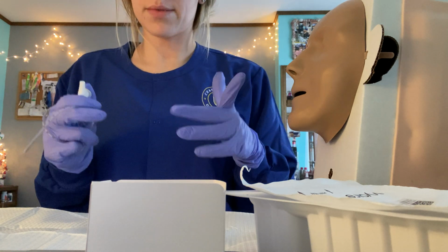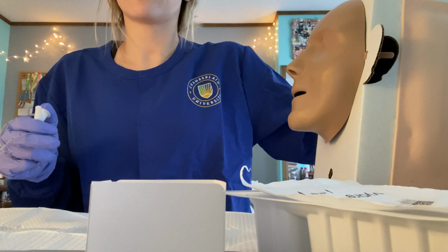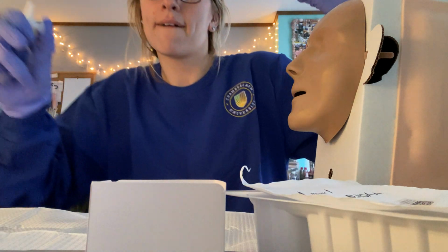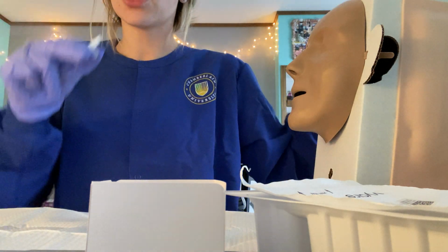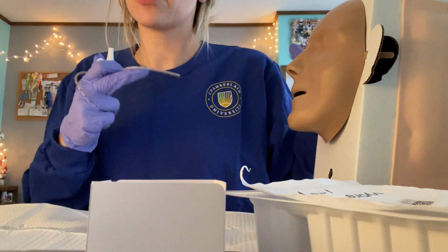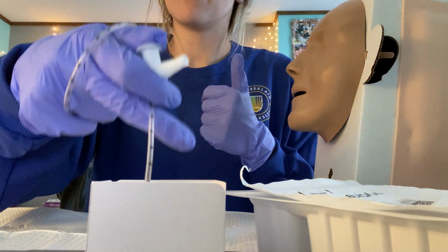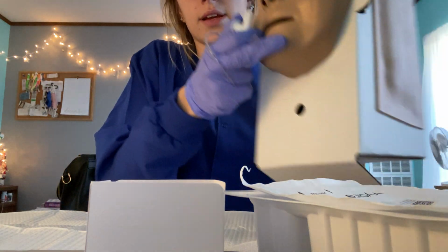Okay, so with my non-dominant hand, I'm going to turn on the suction and I'm going to regulate it. For adults it's from 100 to 110, 115, 120, I believe. Okay, so turn on the suction. And I have my suction tubing in my dominant hand because this is what I'm going to be using. So I dip the catheter in the saline so it's moistened and easier to insert, which is going to be right there.